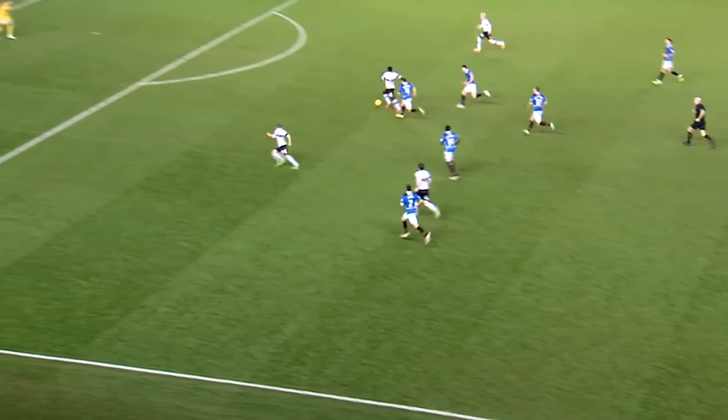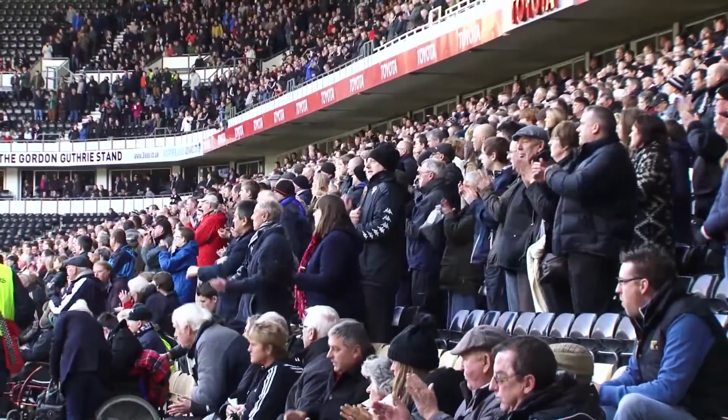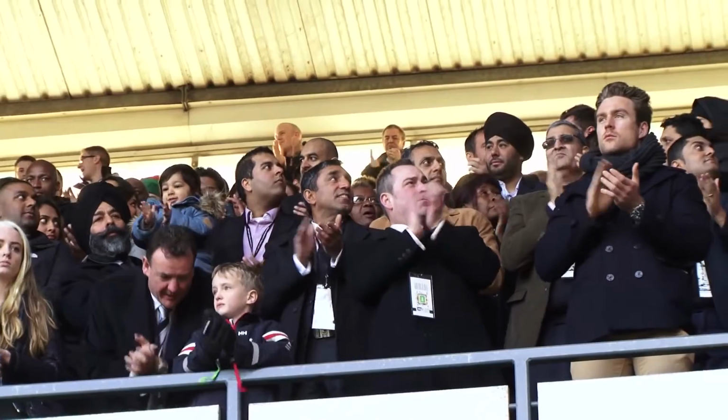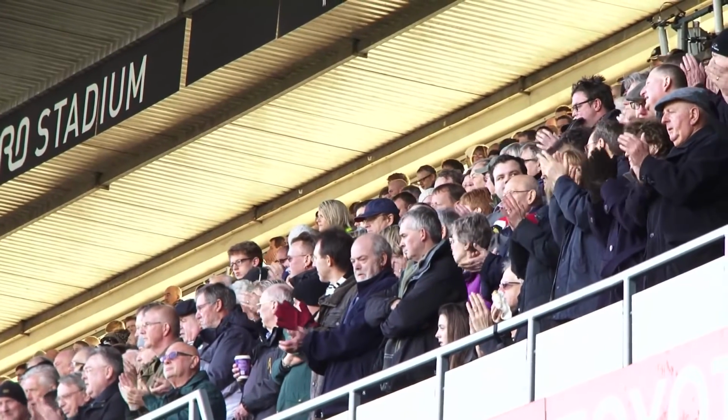Suppose Paul and I went to a football match with the aim of recording the crowd. If I sat in one area of the stadium and Paul in another, the sound of the crowd in the area immediately surrounding us would be slightly different. But other noises, such as the public address system, the referee's whistle, or even a plane flying overhead, will be heard simultaneously by both of us. Therefore, by taking the differential, that is, by subtracting what I hear from what Paul hears, we'll be able to eliminate these common sources of sound.